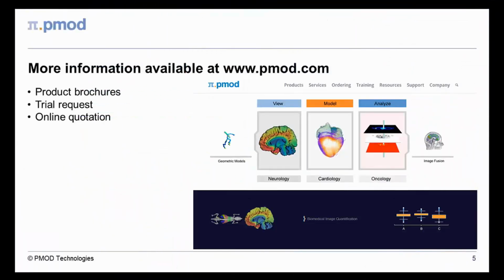This ends our short introduction to the PCARD Cardiac PET modeling tool.